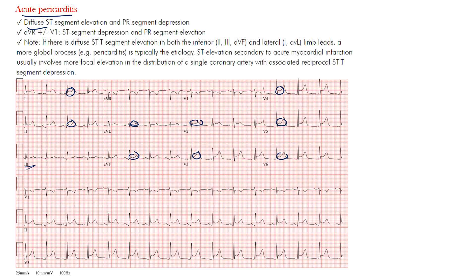You also have concomitant PR depression. If you look at our complexes — this is your P wave, this is your QRS complex, in this case an RS complex, then a T wave. We have our PR interval here, and our ST segment runs from the J point to the beginning of the T wave. We also have a PR segment, which is after the P wave up until the QRS complex.